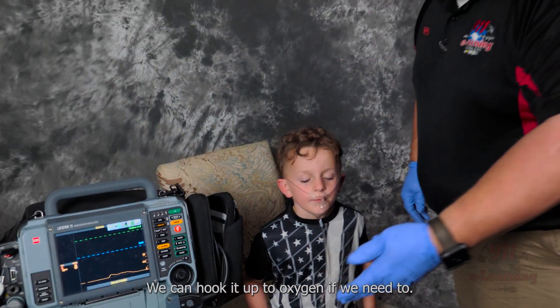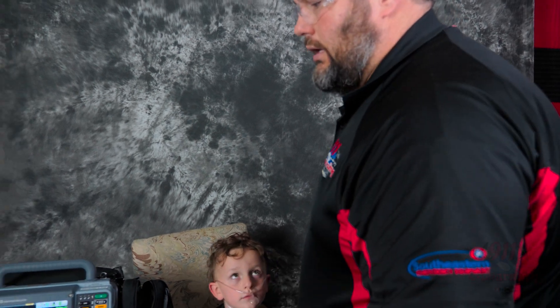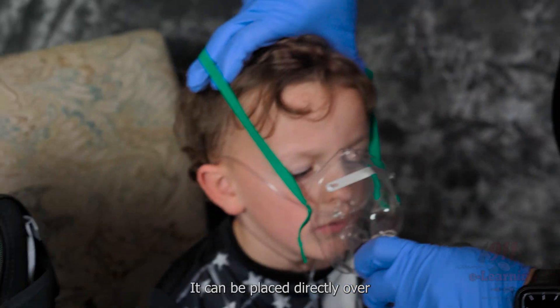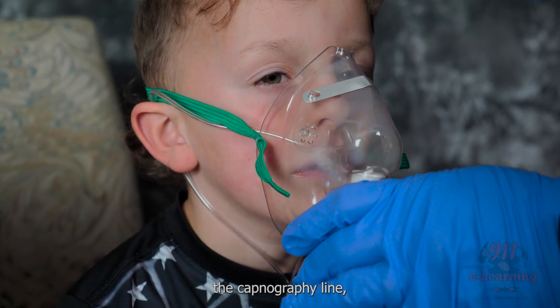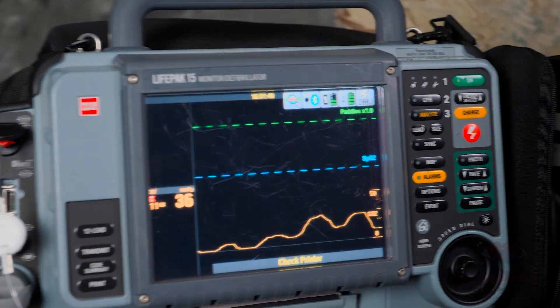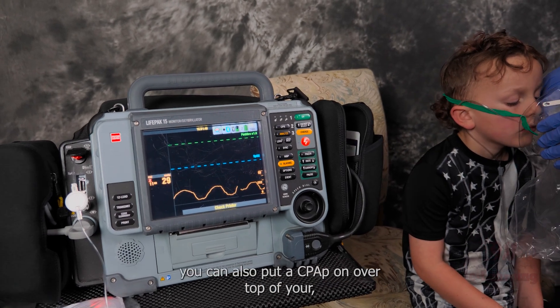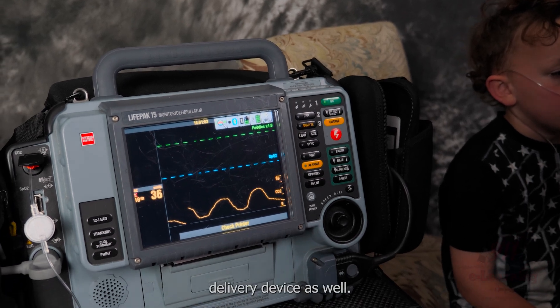We can hook it up to oxygen if we need to. If we need a higher flow oxygen, we can absolutely do that as well. If we need to apply high flow oxygen, we can take our non-rebreather, inflate it, and it can be placed directly over the capnography line and it will still read like it should. You can also put CPAP on over top of your delivery device as well.